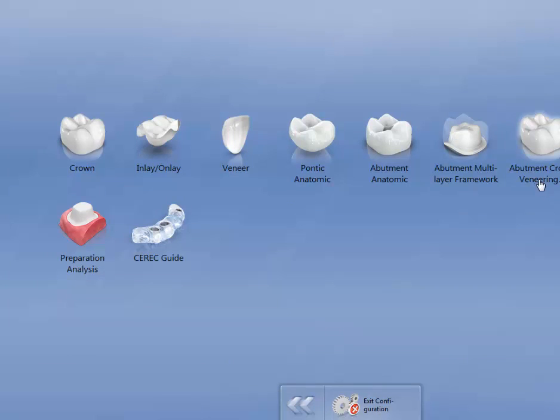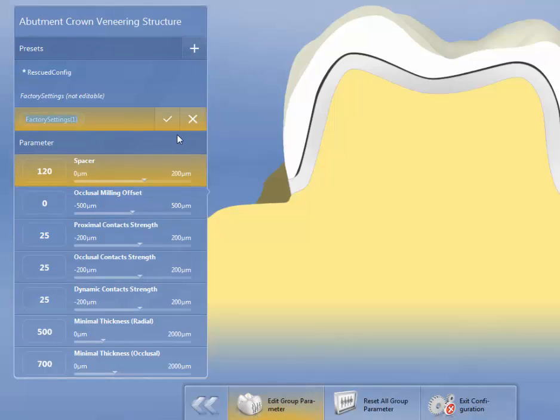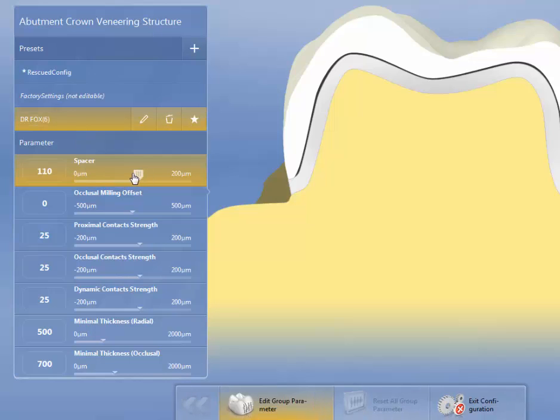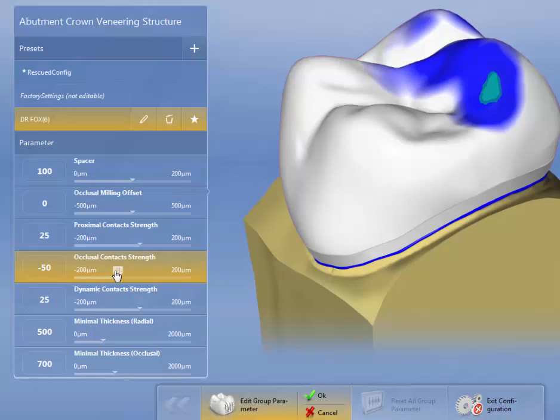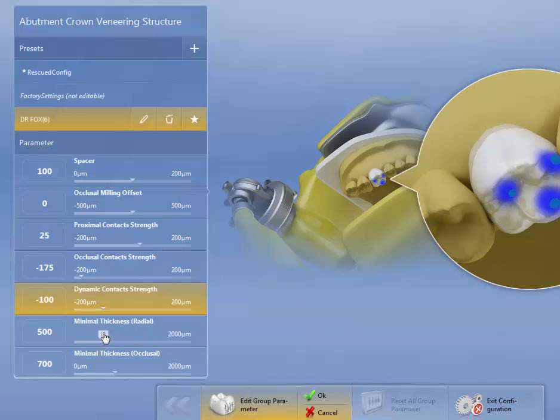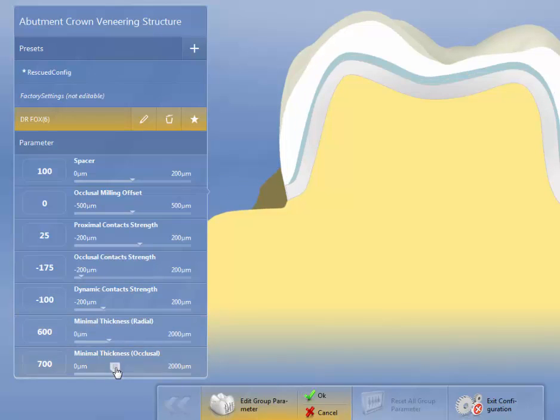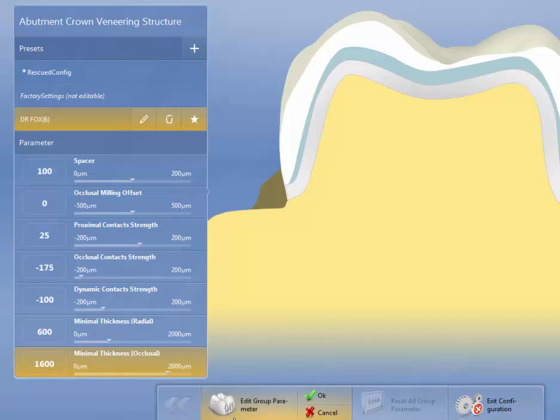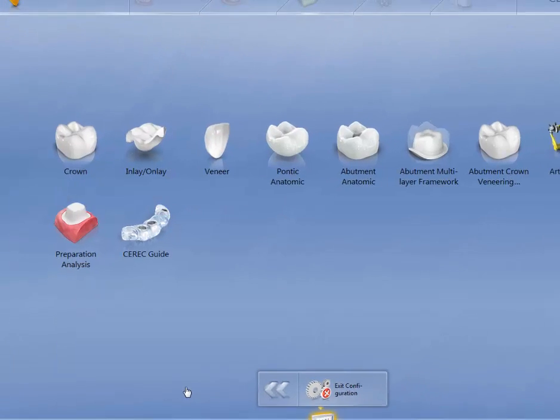I'm going to do Abutment Crown. This is the veneering structure, so this is the over-the-top of my abutment. So I'm going to go in and add my own spacer. Again, I like to have about 100. Zero occlusal milling offset. Proximal contact strength, you can see all these are about the same, except, again, because this is an implant, I'm going to go to minus 175 for occlusal contact strength. Stay at minus 100 for dynamic. Minimal thickness radial, 600, and minimal thickness occlusal, I'm going to do the 1600 again. Again, all of these are just in order to keep this material from fracturing. Then we're going to hit Default, and then OK. Then I'm going to go back.